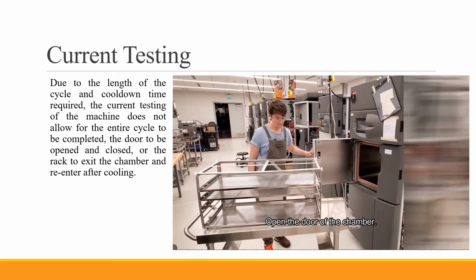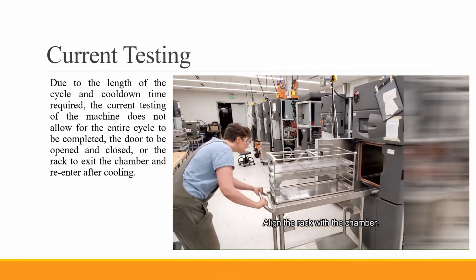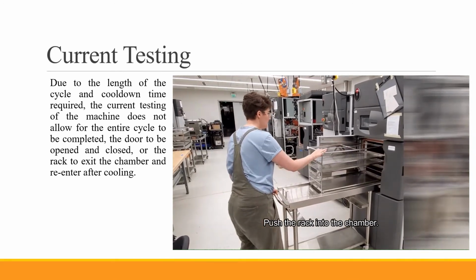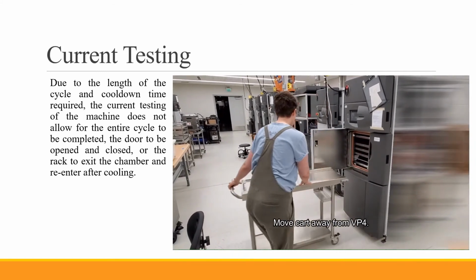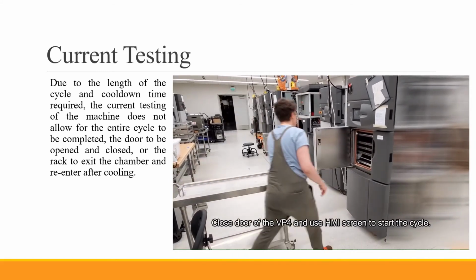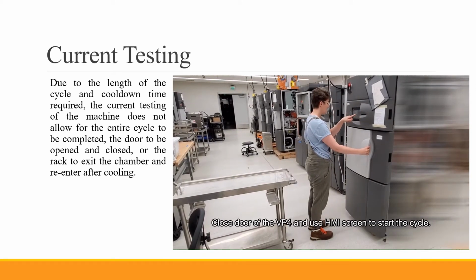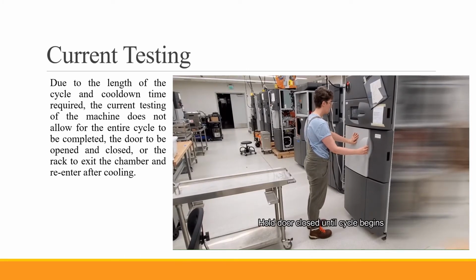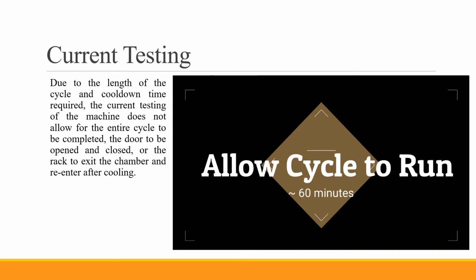So the loading process. The operator opens the door of the chamber, aligns the rack with the chamber on a cart, pushes the rack into the chamber, moves the cart away from the VP4, closes the door, and uses the HMI to start the cycle. The operator holds the door until the cycle begins. The cycle then takes about 60 minutes to run.